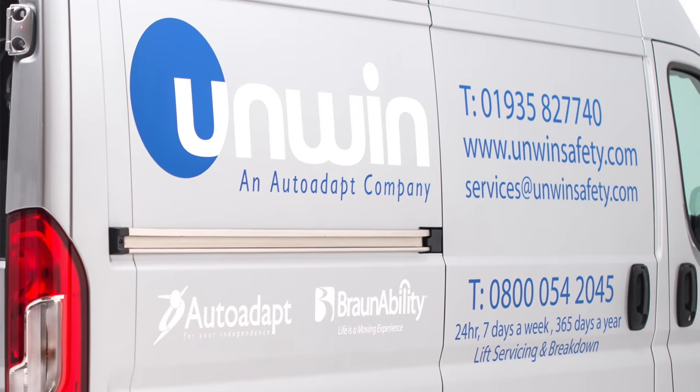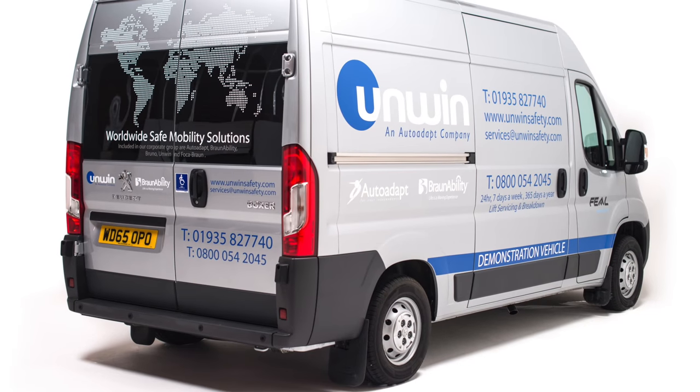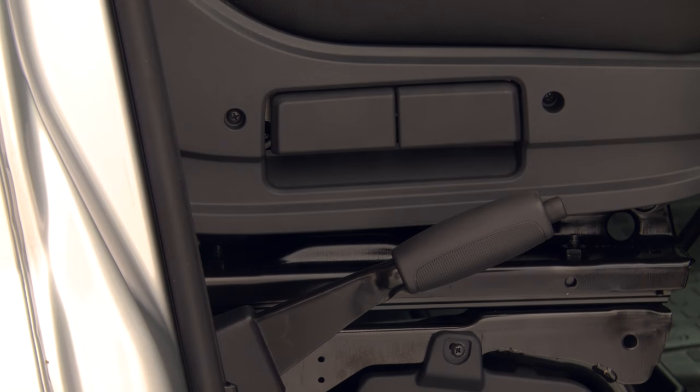Park the vehicle fitted with the Brawnability wheelchair lift in a safe parking space and ensure the vehicle is as levelled as possible to the ground. Once the vehicle is safely and securely parked, actuate the vehicle handbrake.